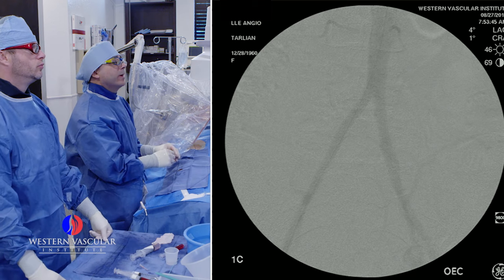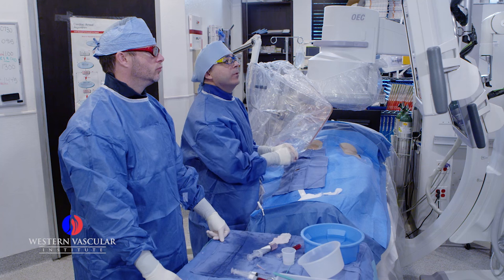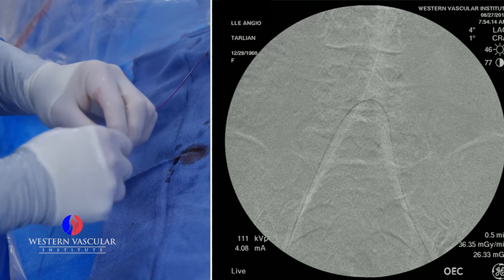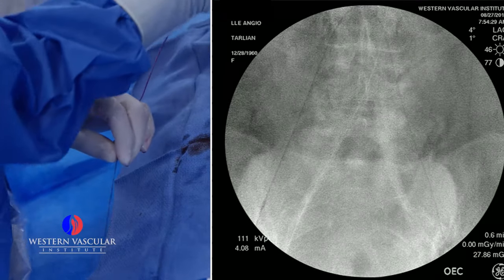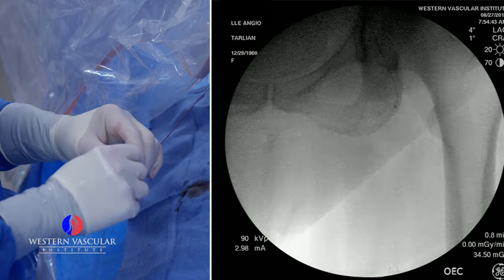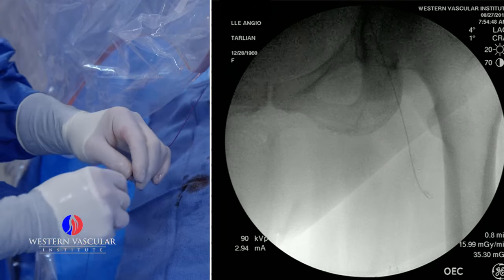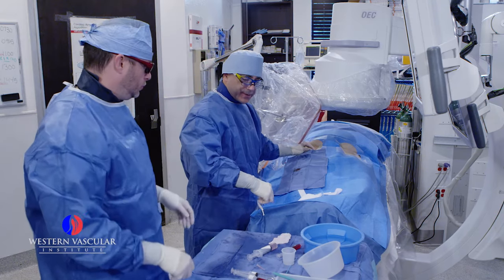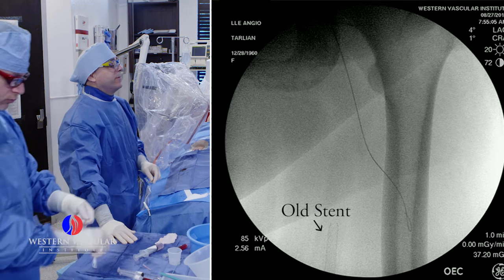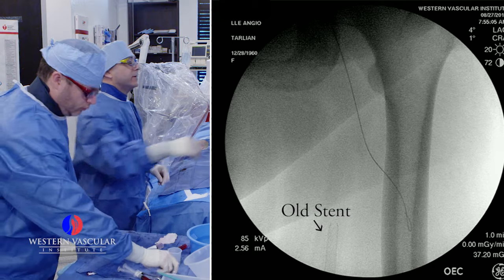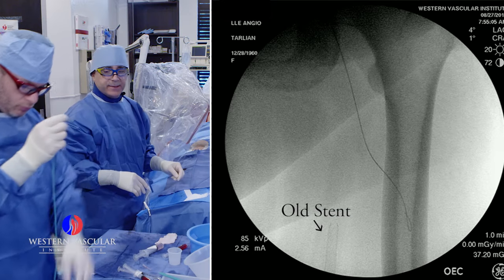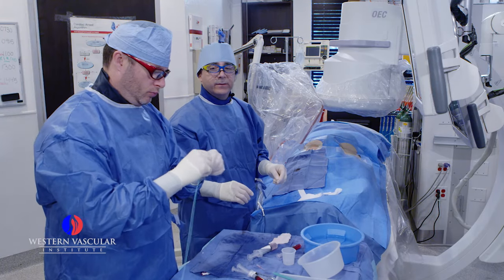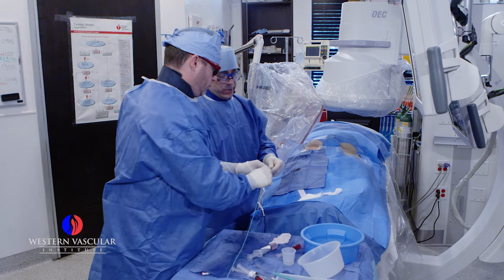We're in the abdomen and we want to take pictures of the arteries in her leg, which is where she has most of her symptoms. Now that artery that we're in is called the profunda artery — that goes into the thigh. We want to get into the blood vessel that goes down into the calf. You can see at the bottom of the screen there's a metallic object right in the middle of the screen. That's a stent that's been placed there in the past. A lot of times these stents will form scar tissue on the inside, and that scar tissue most likely is responsible for the recurrent symptoms.